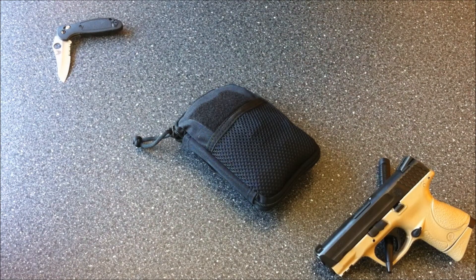Good afternoon, this is David with the Seer Talons series. Today I wanted to show you my trauma kit that is specifically designed for penetrating trauma such as gunshot wounds and stab wounds.